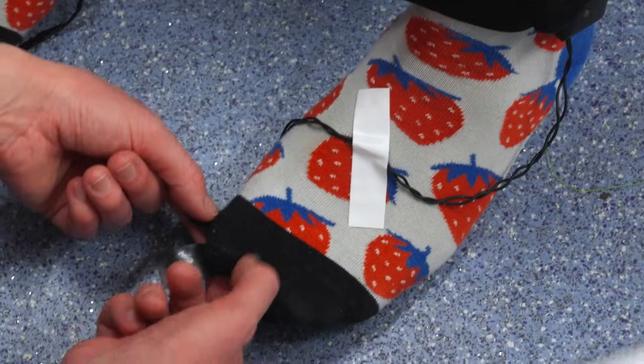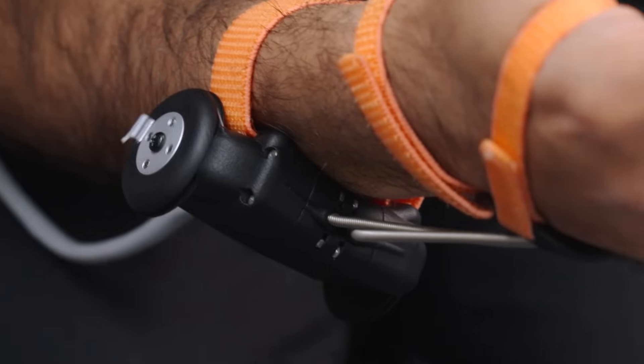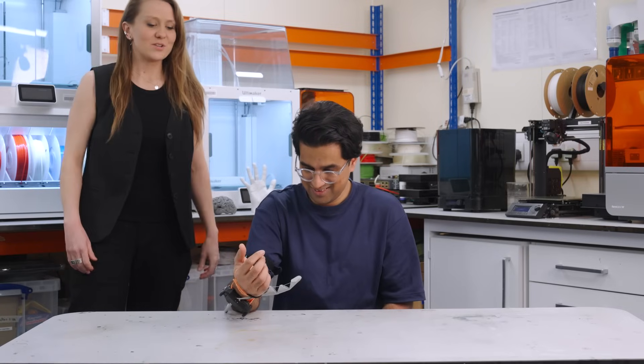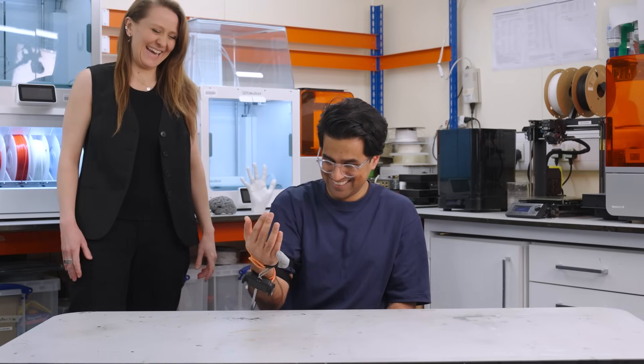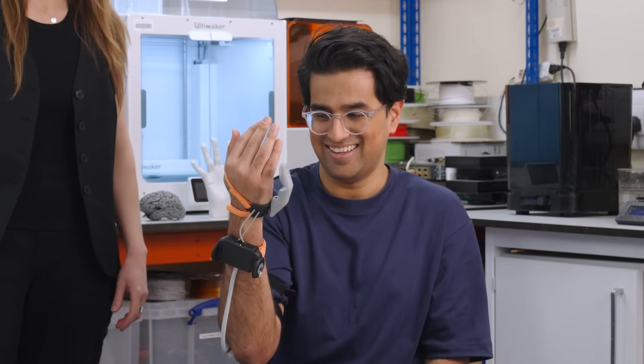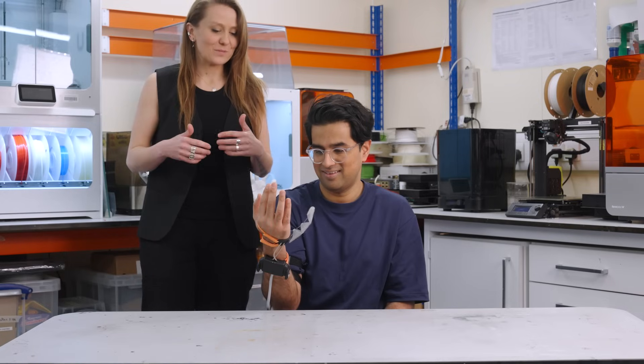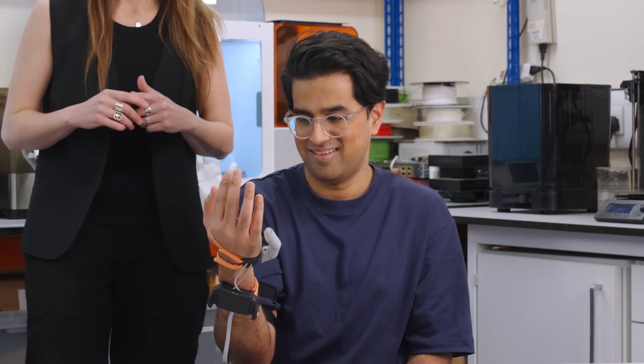Obviously, I had to try it for myself. You've got two pressure sensors, one underneath each big toe. It's basically a pulley system, completely flexible 3D print. Now press your toes down. That's your left toe. That's so cool. And then your right toe does a press. So I can move it. Give a really slow, delicate press. You'll see that there's a proportional control. You have a lot of control over it. Or you can do a fast, quick press.